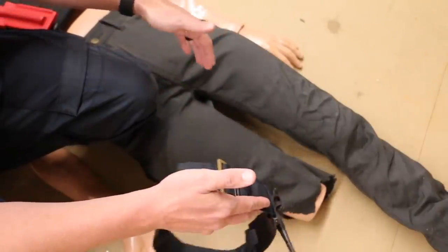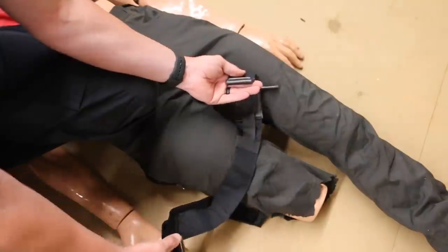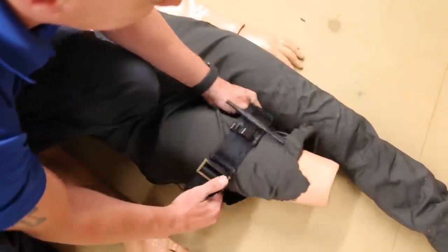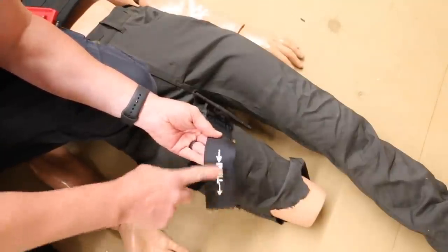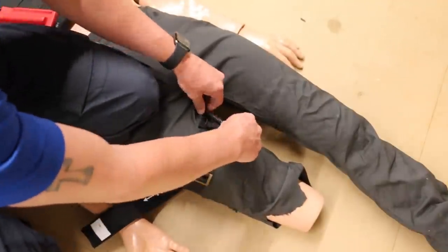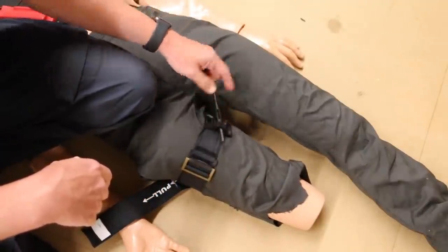If you're applying the tourniquet to someone else, ideally hold pressure to slow down the bleeding. You can loop it through or disconnect it and apply it. Let's loop it through his extremity here — pull this strap towards you, get it nice and tight, and turn it until it locks into place. You'll hear it click to confirm it's locked.